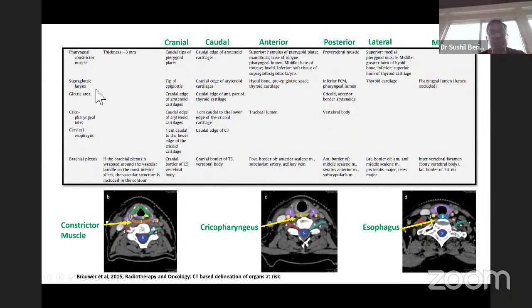Other thing which you have to contour is the larynx, glottic and supraglottic area, in the oropharyngeal cancer. There are studies to show that as the mean dose to the glottis goes above 20 gray, the voice quality goes down. I know in some of the literature they talk about 40 gray, but in the modern era with IMRT and VMAT, we try to limit the glottic dose to 20 gray. By doing it, there is some underdosing in the medial neck node, which is acceptable for N0 disease. But as you increase the dose above 20 gray, the risk of voice dysfunction goes up.